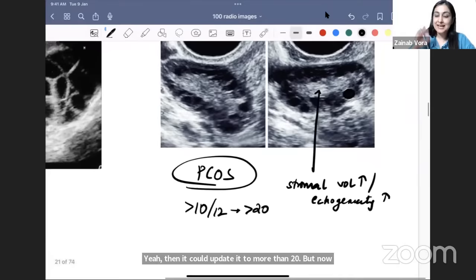The two RGU images differ: in one, extravasation is still somewhat limited — this is a partial urethral rupture. In the other, contrast is going all over — this is a complete urethral rupture. This is the key distinction between partial and complete urethral rupture on RGU.